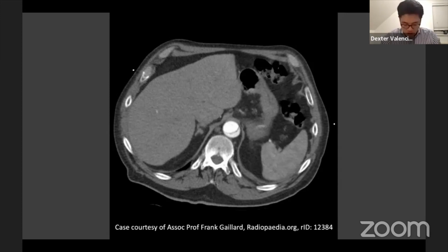Okay, so I've got two good questions from Nicola White. So one is, why are normal PICCs not suitable in CT scans? So the issue with normal PICCs is that whenever we want to give a lot of contrast for the CTPAs, what happens is we connect them to a pump and we put a lot of pressure on this mechanical syringe. And what happens is if you blast a lot of contrast through a normal PICC line, the end of the PICC will actually explode and you can get bits flying off into the patient, which is really bad. So that's why we don't use them.